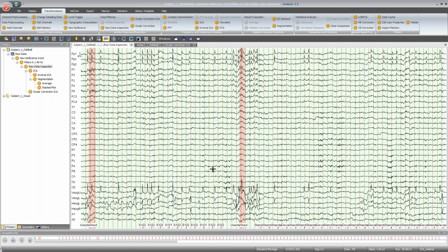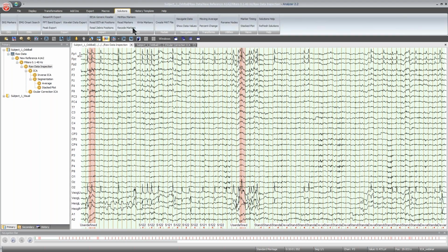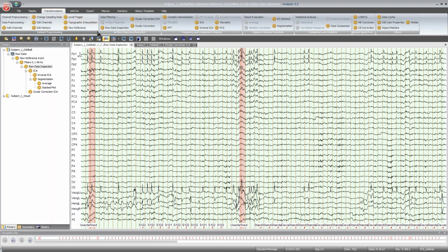I have selected this question because meanwhile we have changed our set of official solutions from our website, and actually this solution is not in here anymore. But of course it might still be that a lot of you have this and have used this regularly. You can still use this. However, we would actually encourage you to use the inverse ICA instead because it's just more stable. The solution is very old and a bit outdated and no further maintained, so it sometimes runs into errors.